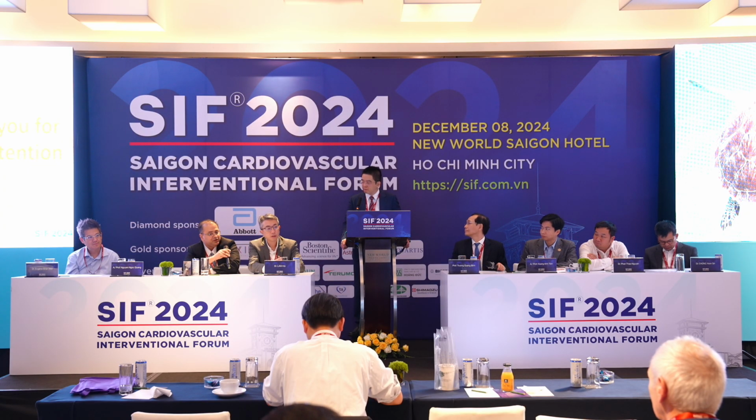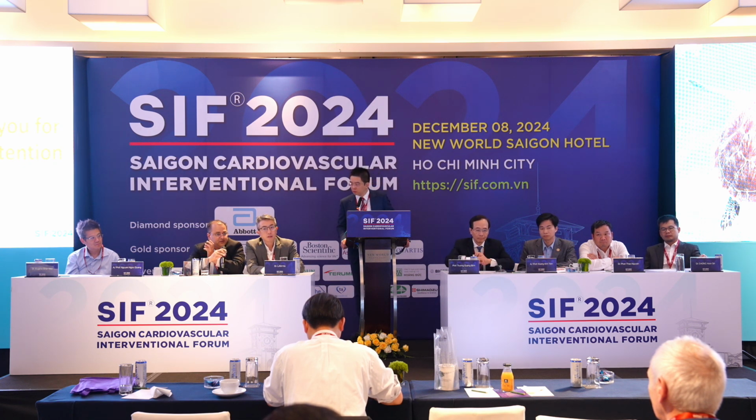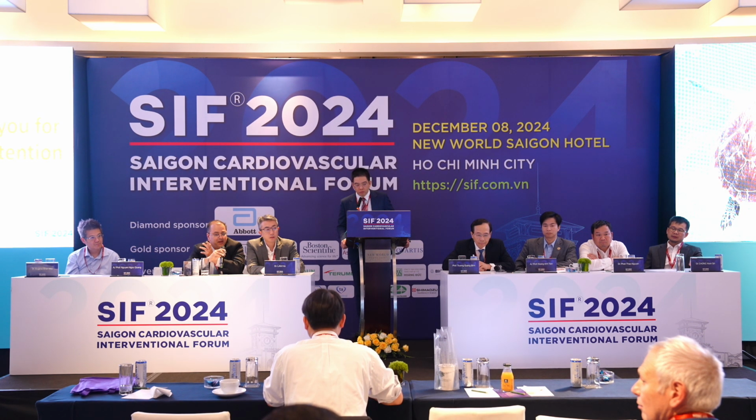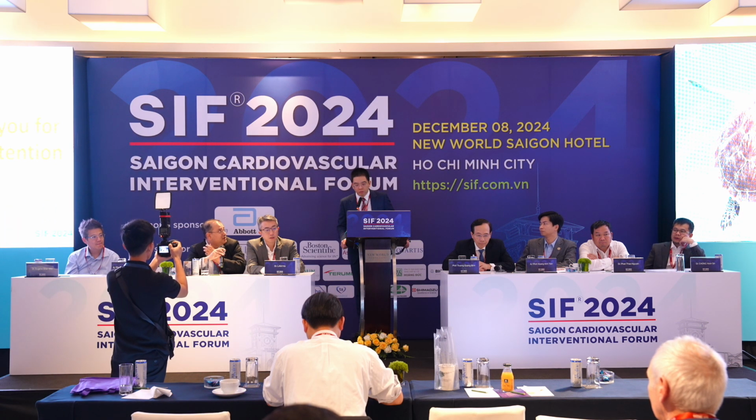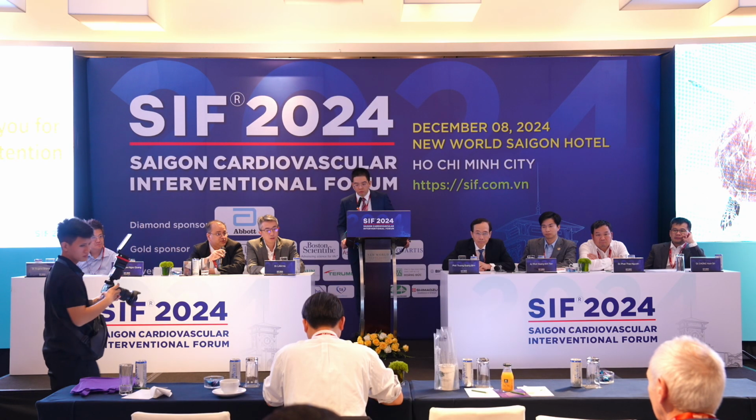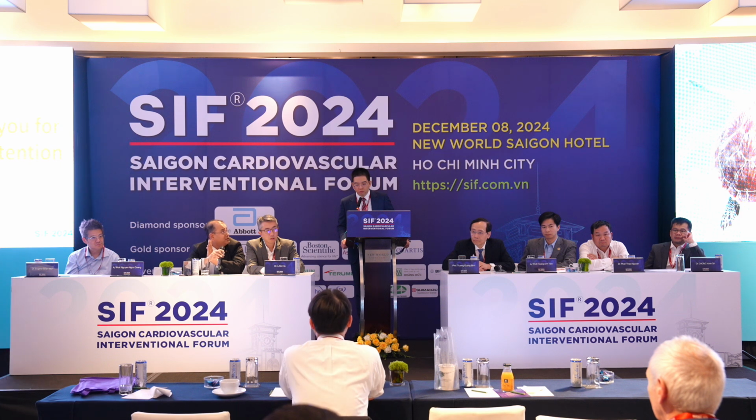Hi, I'm Asri. Very good case. I think one of the issues is this is a very unusual graft. I've never seen such a short graft going to the side of the RCA. Most of the time, these filter retrieval devices are meant for straight grafts, not ones with such angles. So I might not even have used the retrieval because when you pull back over a very unusual angle to come down, there is a possibility for the device to get stuck.